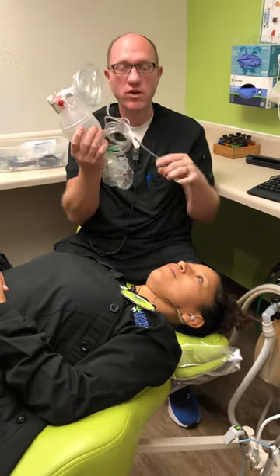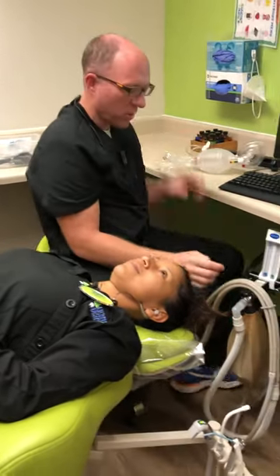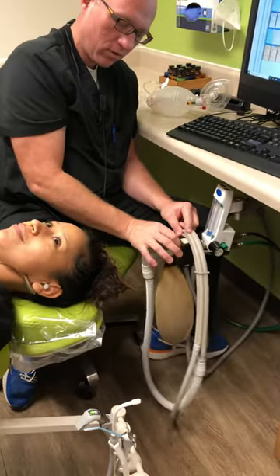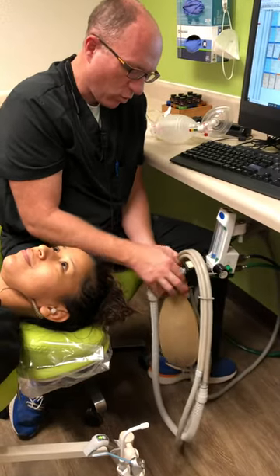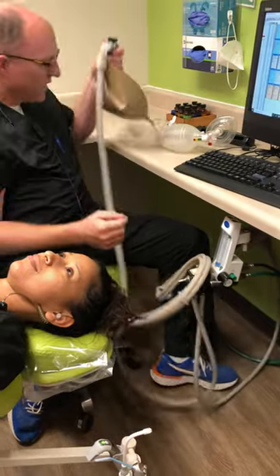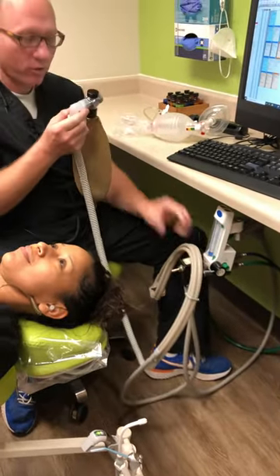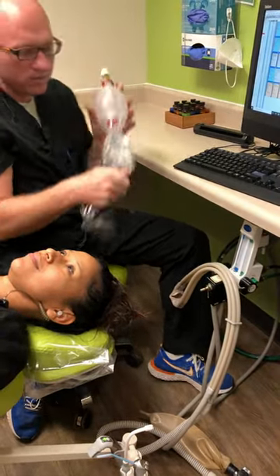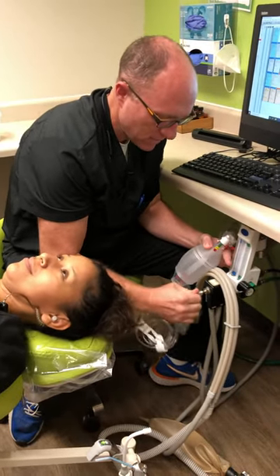The next thing we're going to do is get oxygen flowing inside of it. To do that, we come over to our flow meter here. On the very front, there's a silver piece right here in front of where it attaches. That quickly unscrews in about three or four turns, and when that comes off, it leaves this metal nozzle. In a hurry, we're just going to take this off and drop it on the floor. Then this tubing comes along and the clear end is going to press into here tightly.